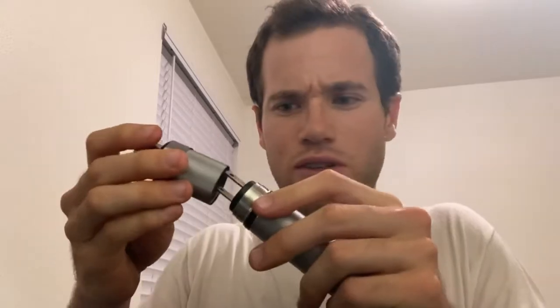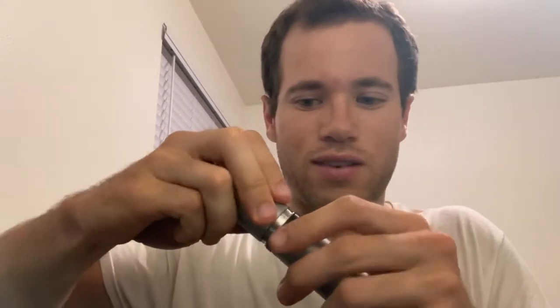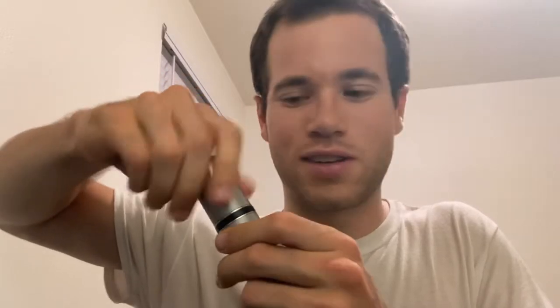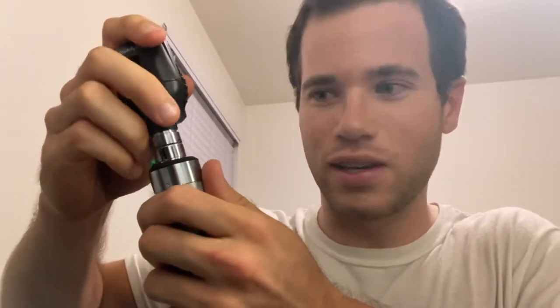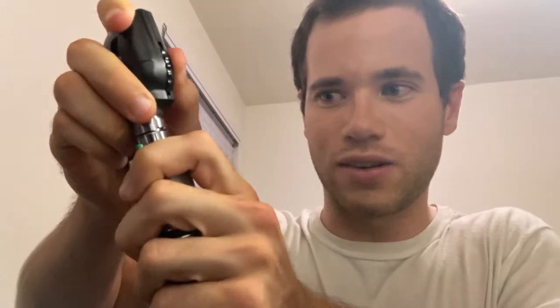This thing threads right back on like this — you don't want to cross-thread it — and that forms the base of your really fancy light bulb. Then you take the actual ophthalmoscope head and connect it: there are little metal grooves and some indents, so you just push it in and rotate it clockwise until it stops rotating.